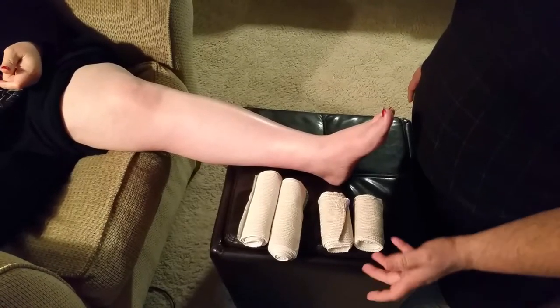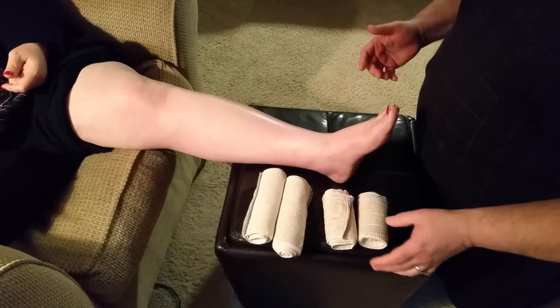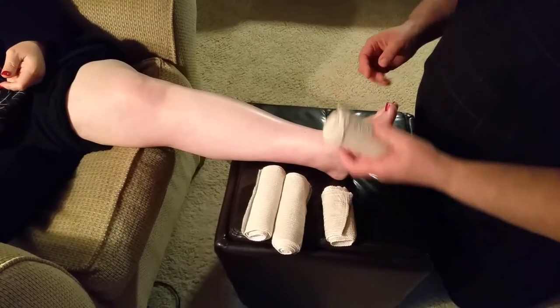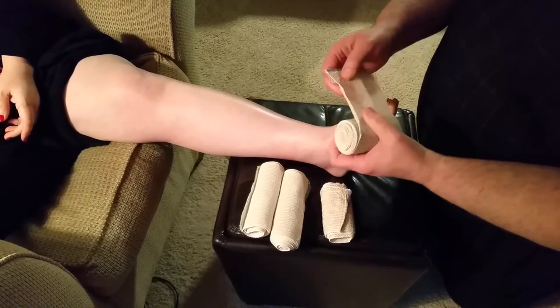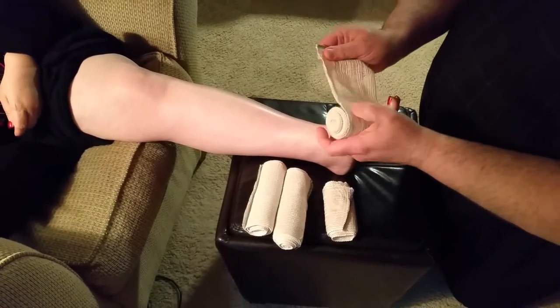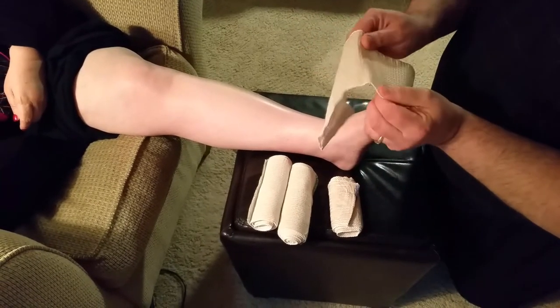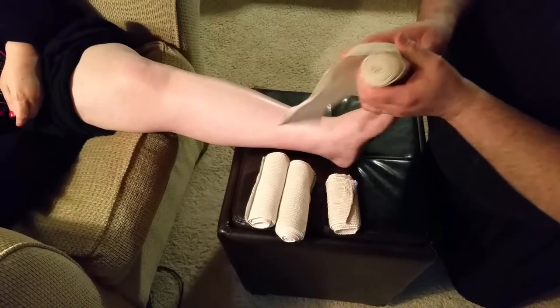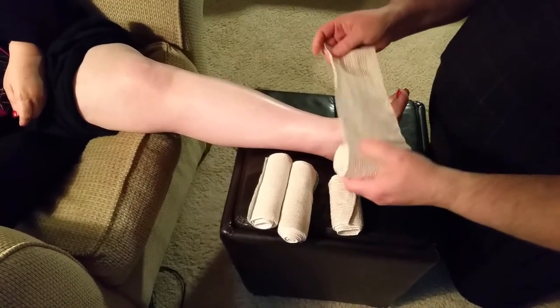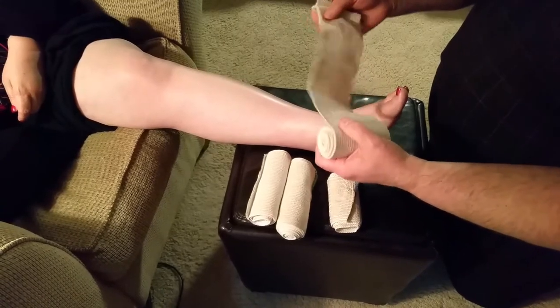First, we're going to do a simplified edema wrap as I was taught in the hospital. They gave me these wraps — they have some velcro on them. They stretch in the long way but not so much sideways. So when we stretch, we stretch it out well.